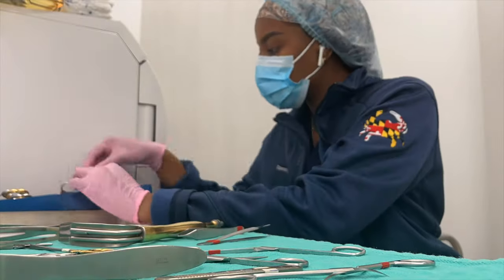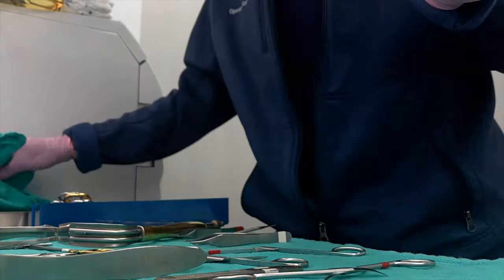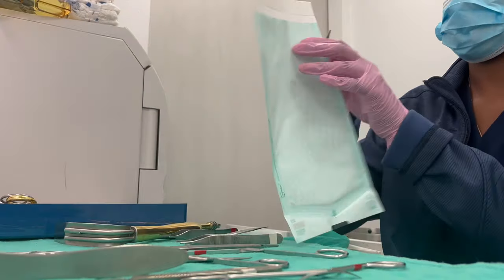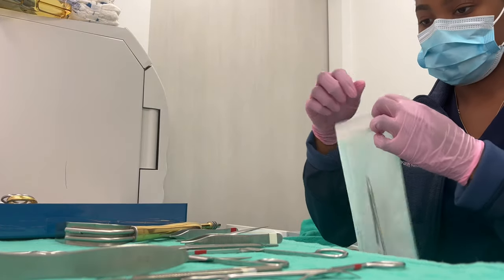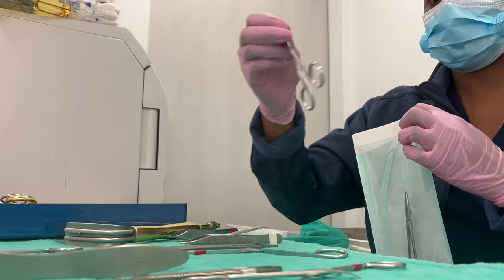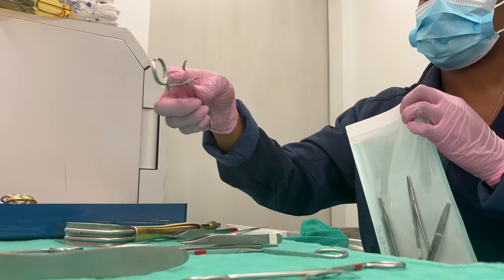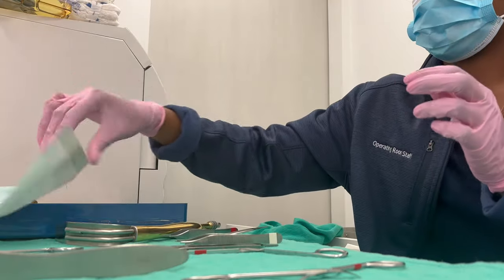And then I'm remaking my instrument tray. That was the tray that you guys saw me open. I'm putting stuff back in the tray where it belongs. Then I put the other instruments that were in pouches into pouches to go into the sterilizer. We have instrument tray pans, and then we have these little sets called basic sets, which we use when we do local procedures, when we're not doing anything crazy.